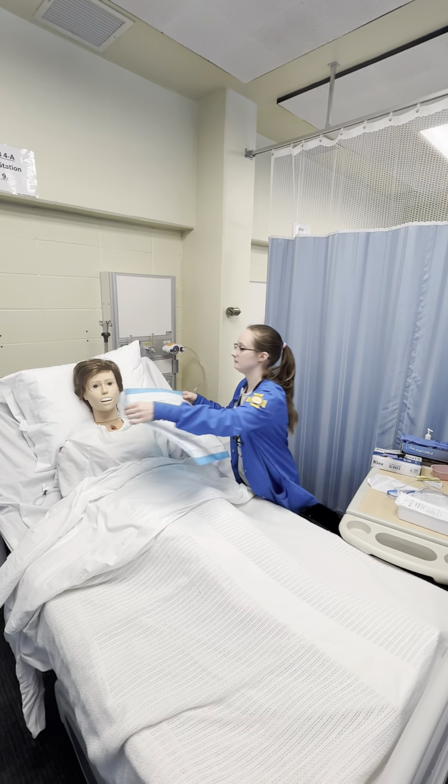I want to get my pH strip out and ready. I'm going to wash my hands, do my hand hygiene, and put on my clean gloves. I described to the patient what this procedure is going to consist of. This is just to catch any type of mess that could happen.